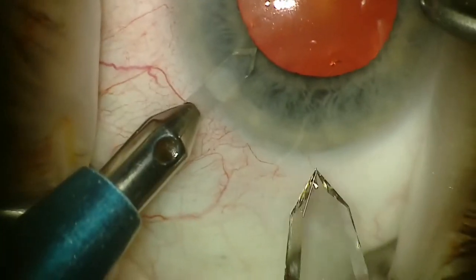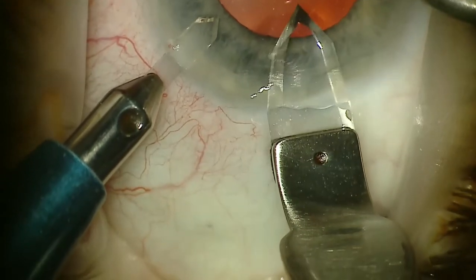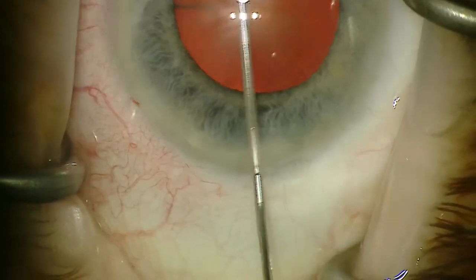This is Michael Patterson from iCenters of Tennessee. I just want to show you our technique at iCenters for when we do cataract surgery combined with a Kahook Dual Blade as well as ECP.